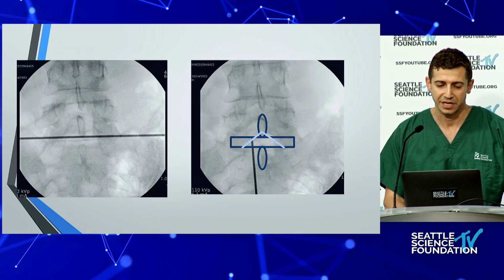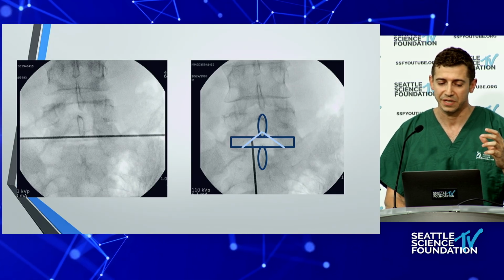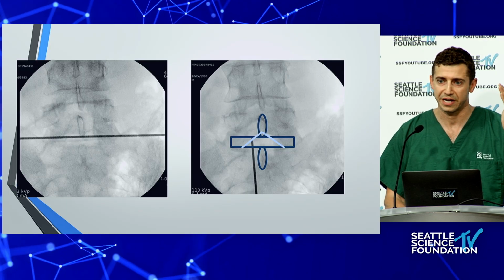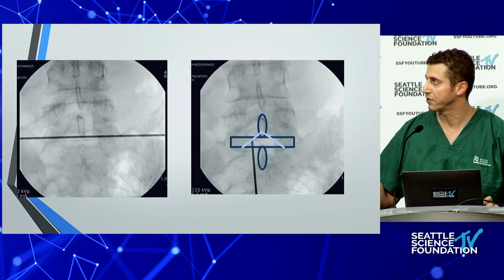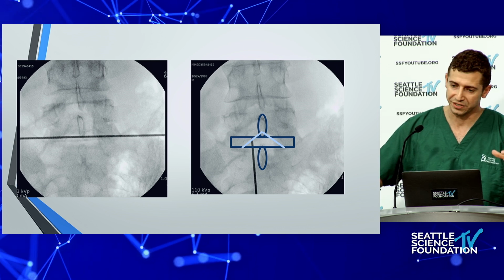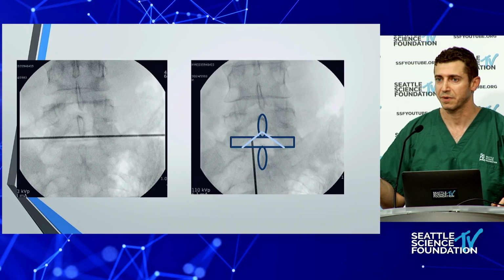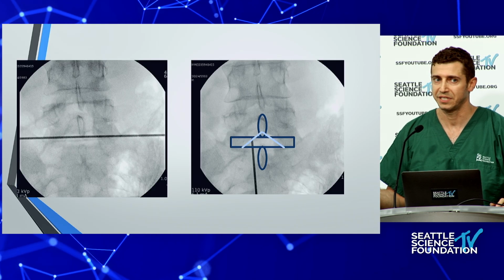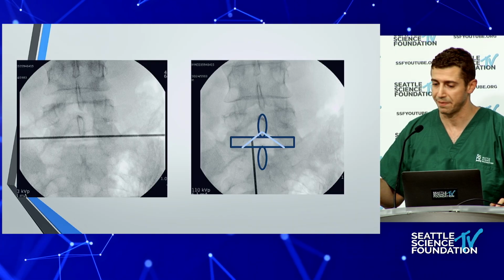In terms of the interlaminar approach, Dr. Kim went through the details of it. It's easiest done at levels where the interlaminar window is huge, and you want to tilt the X-ray intra-op to get the window to be biggest. That's what you see here on the right side of the screen: you're getting the Ferguson angle of the table, or you're tilting the patient in a way to maximize that window. And the great thing about endoscopy, and what separates it from doing this through an open approach or a tube, is you really don't have to take any bone down to remove a disc herniation in most cases if you have a large interlaminar window like that.